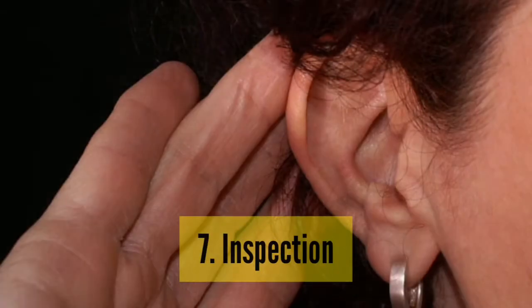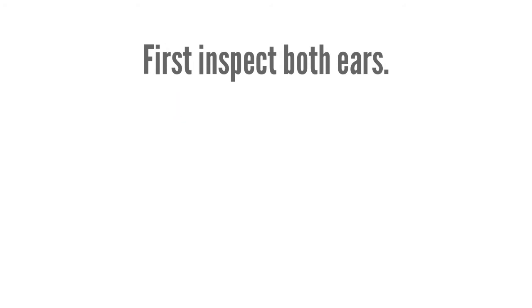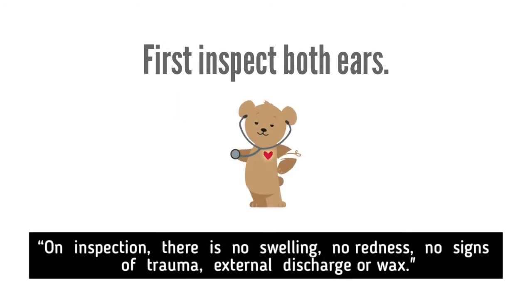Inspection: First, inspect both ears. On inspection, there is no swelling, no redness, no signs of trauma, external discharge or wax.